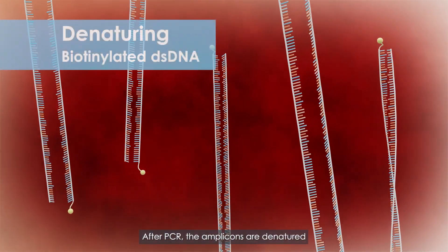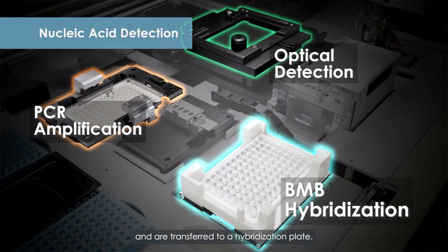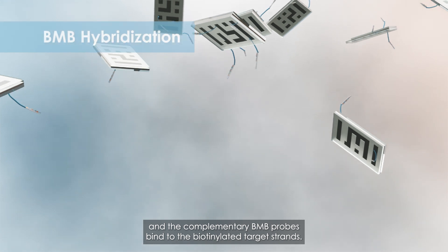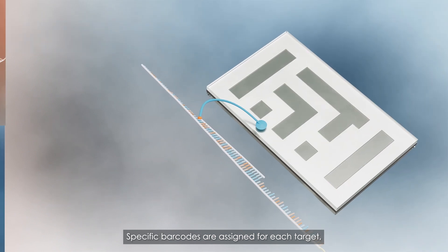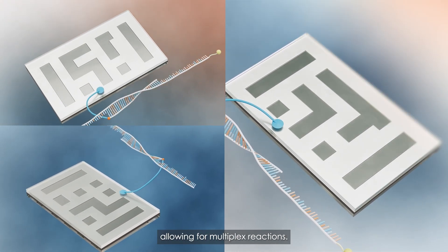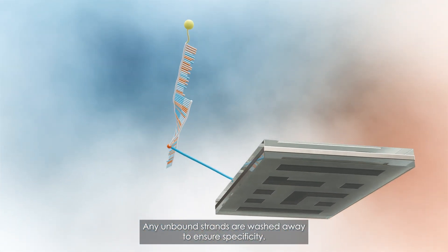After PCR, the amplicons are denatured and are transferred to a hybridization plate. Biocode BMB probe mix is added, and the complementary BMB probes bind to the biotinylated target strands. Specific barcodes are assigned for each target, allowing for multiplex reactions. Any unbound strands are washed away to ensure specificity.